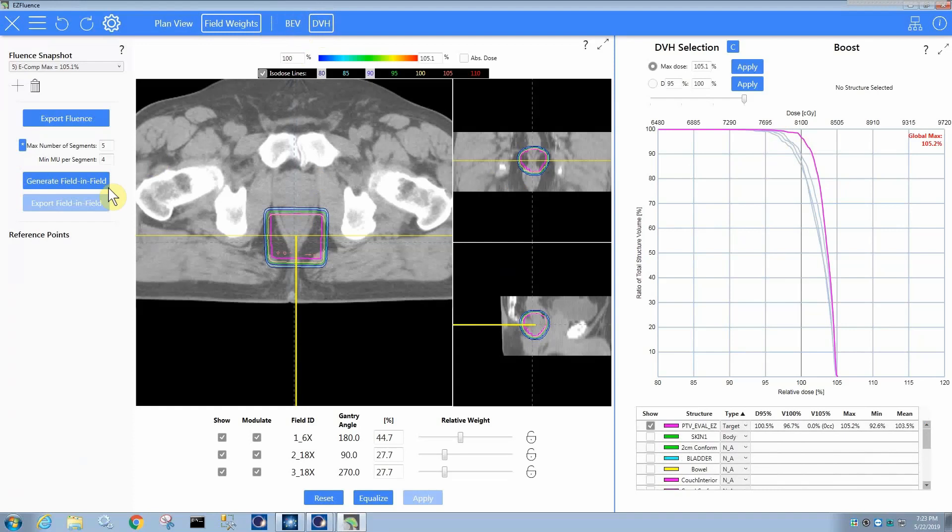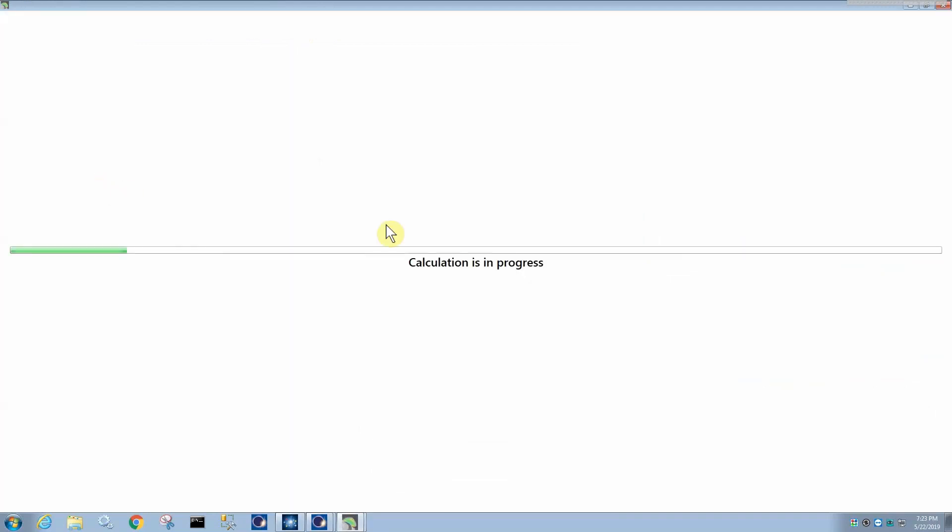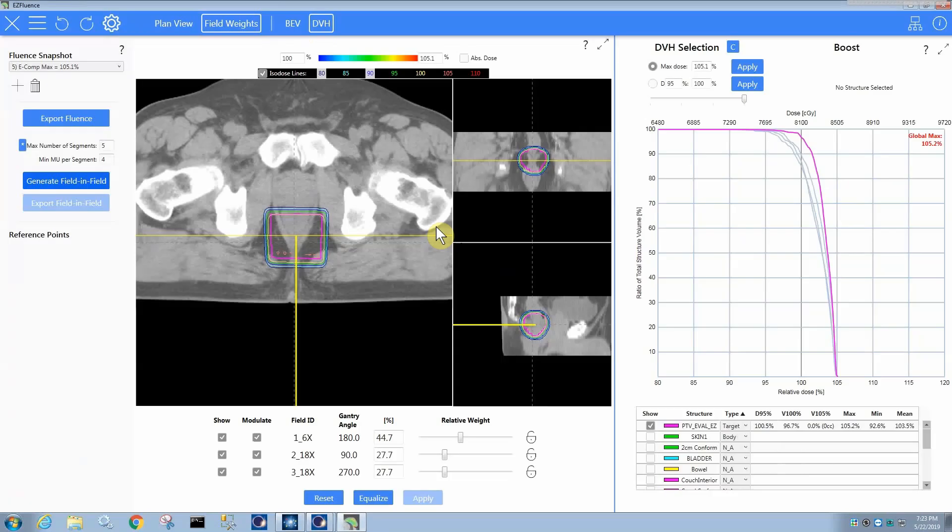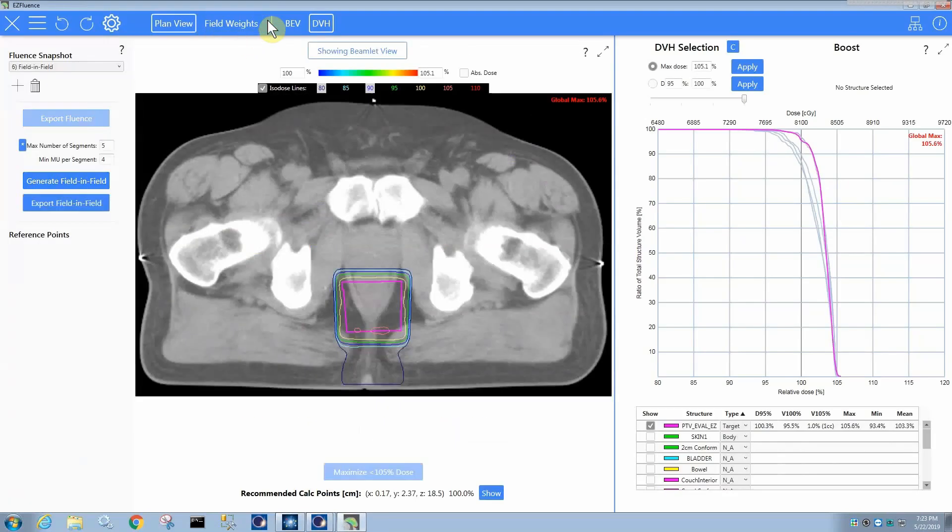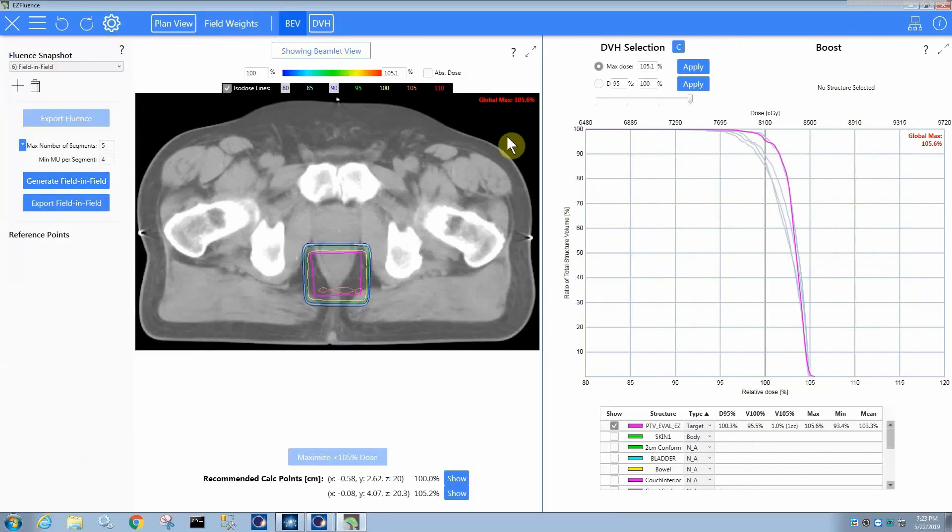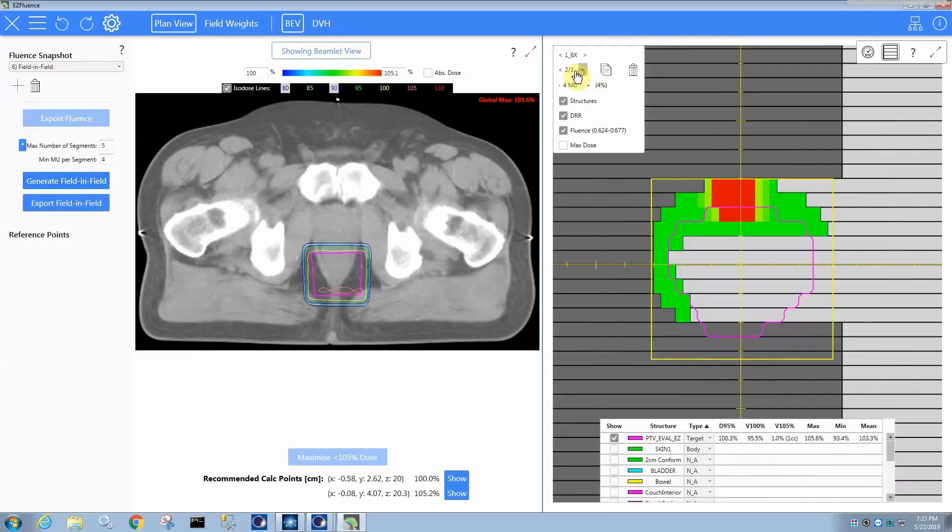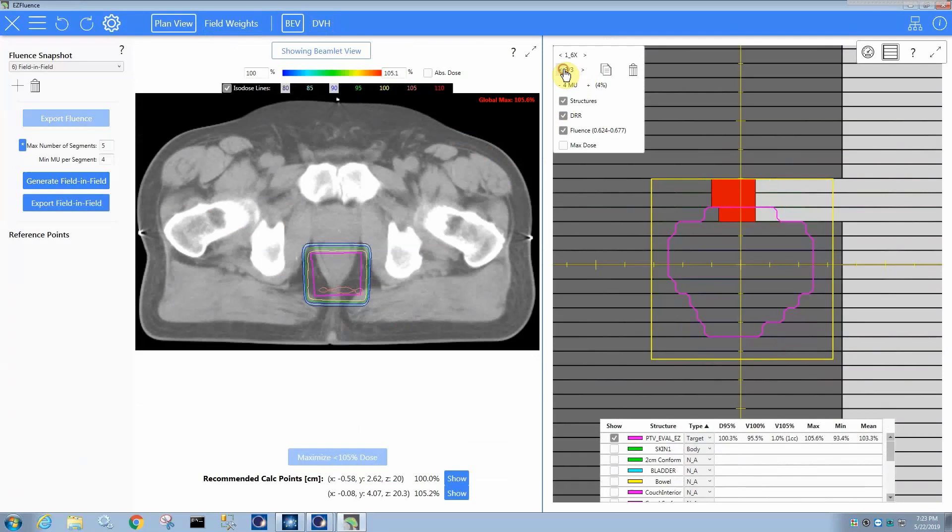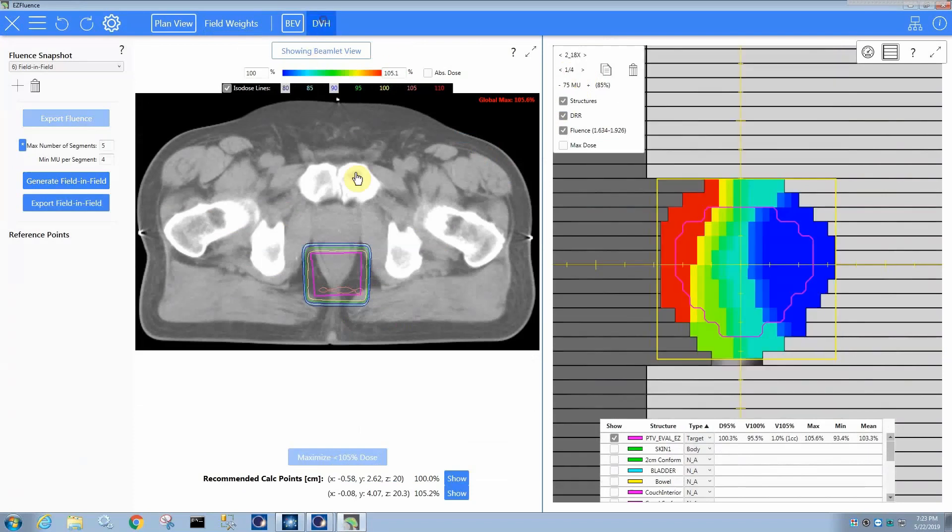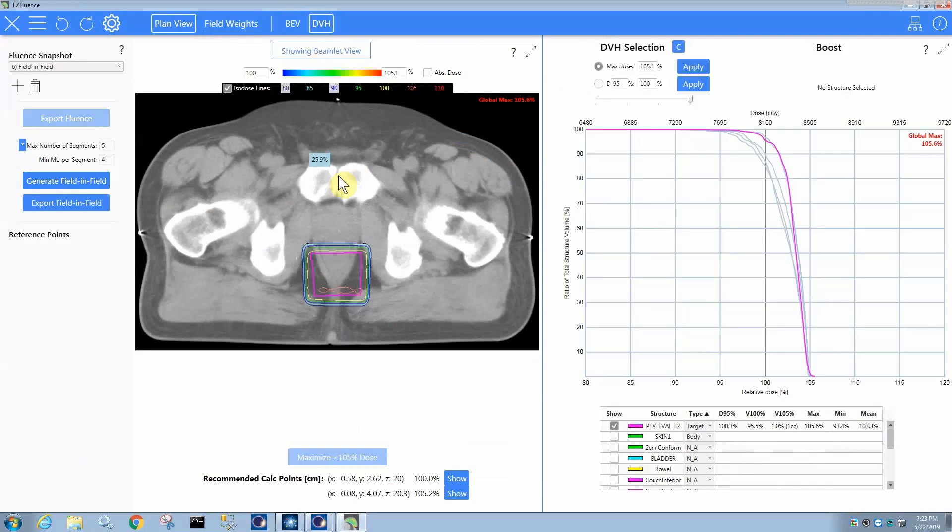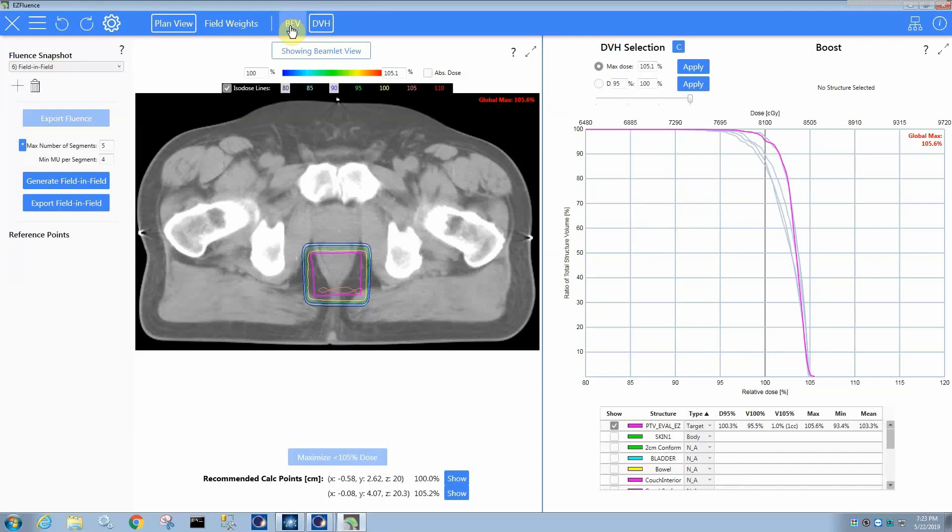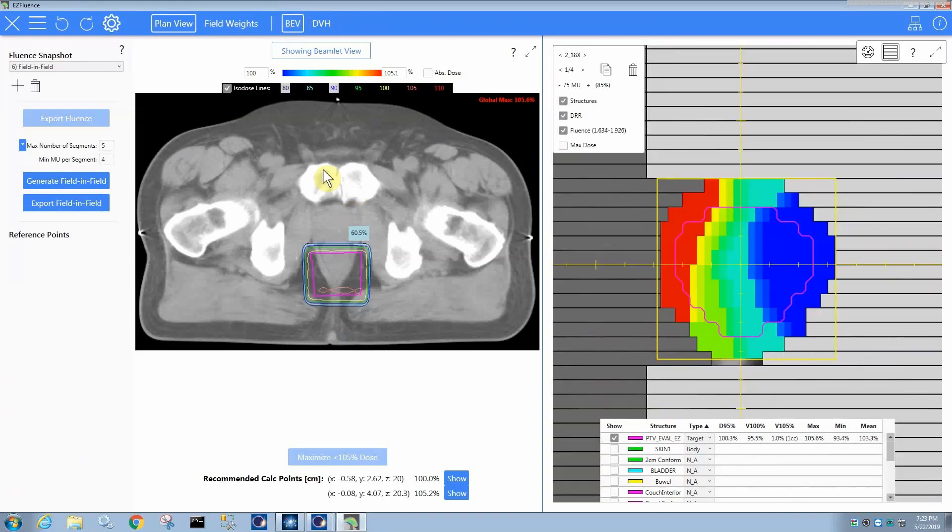If you generate a field-in-field, it will of course generate subfields for that, the PA field as it can, given that a small amount of modulation, we'll see how many it only generated three subfields for it, it seems. So in any case, it will work with what you give it. But again, if you want to use it as your 3D planning assistant, then it makes a lot of sense to decide which fields it makes sense to modulate and just modulate those.